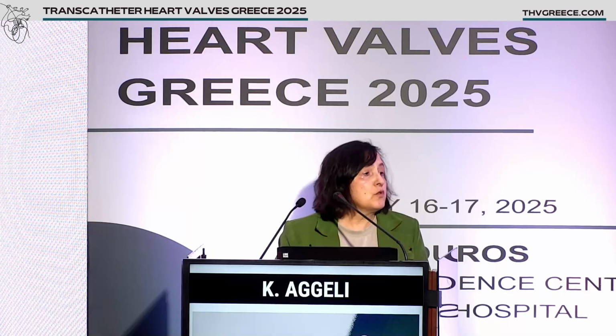What is your screening method nowadays? Are you the one who decides if a patient is a good candidate for TEER in the tricuspid valve? Is it a heart team approach? I think it's a heart team approach, and we discuss every case. We're going to decide which procedure we have to select.